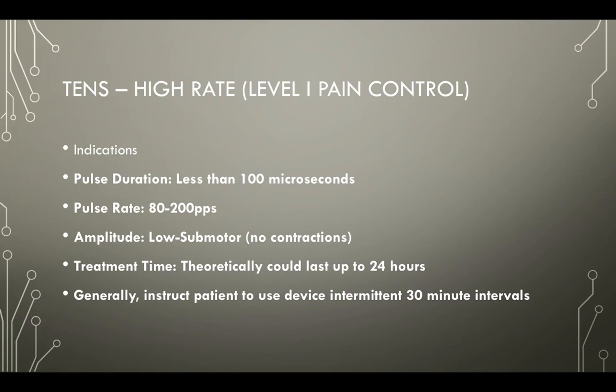Once you finish this video and you get to start practicing on the machines, you'll do an activity where you change the pulse rate while the treatment's going, so you can feel the differences between those different pulses. And there's no right answer to this. You have to pick these numbers kind of arbitrarily sometimes at first, based on your experience from practicing and areas you like, but then also adapt them to your patient. So try a number. If the patient likes that, we can stick with that number. If they maybe need more or less, we can alter. If we're getting muscle contraction, we can change the duration and the pulse rate, things like that.